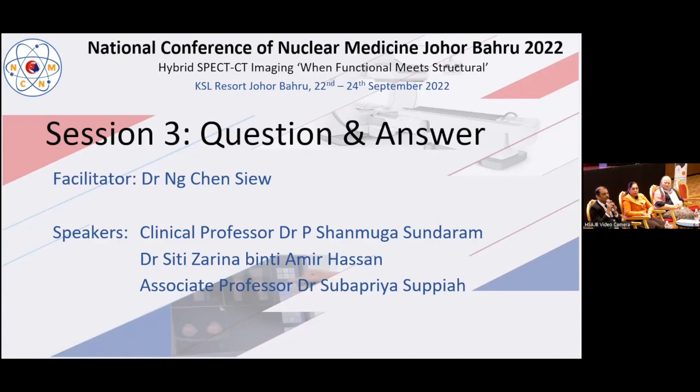So if there is no uptake, or if the planar scan is negative, you will do it twice. If your initial scan shows some uptake, you will do only once at 1 hour. That is what is rapidly washing out, a parathyroid adenoma. So in that case, if you had done the SPECT-CT at 1 hour, you would have localized it to non-thyroidal uptake. So you know the fact that it is a parathyroid adenoma. So that is where the 1 hour delayed SPECT-CT is relevant.